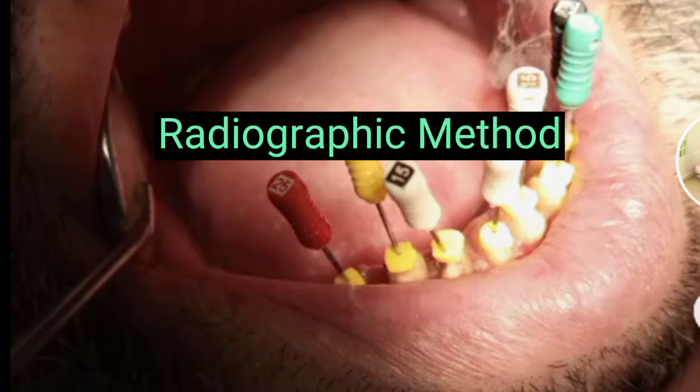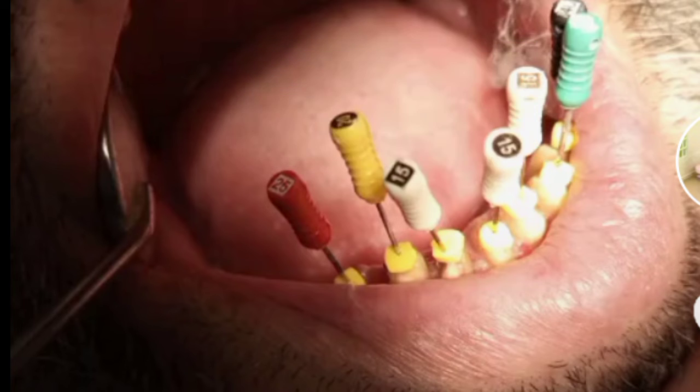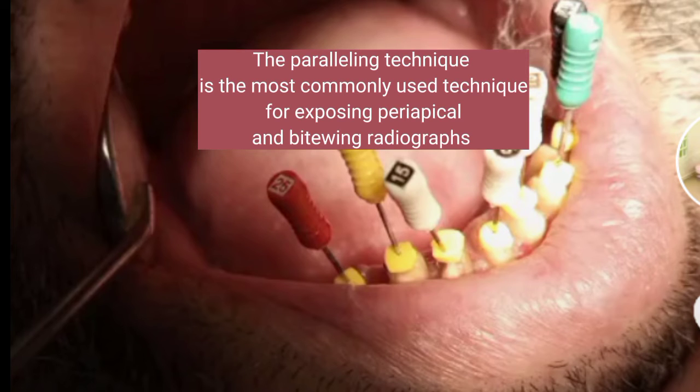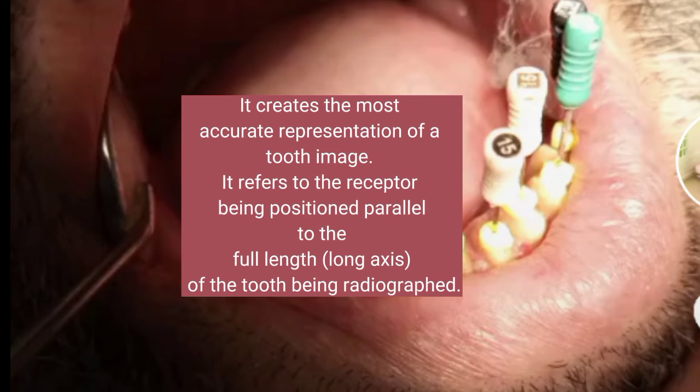Radiographic method. Traditionally, the method of determining the working length is by taking a radiograph with files in the canal. A good quality radiograph has to be taken using the paralleling technique with the help of an aiming device or image receptor holder. This technique is the most commonly used technique for exposing periapical and bite-wing radiographs. It creates the most accurate representation of a tooth image. It refers to the receptor being positioned parallel to the full length of the tooth being radiographed.